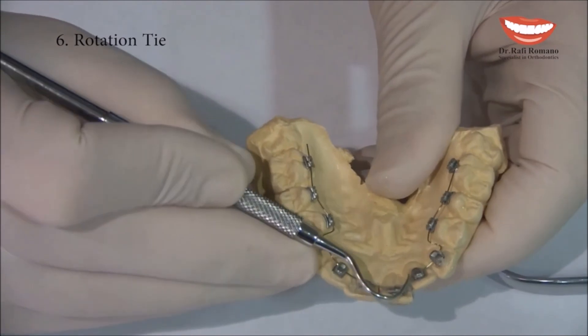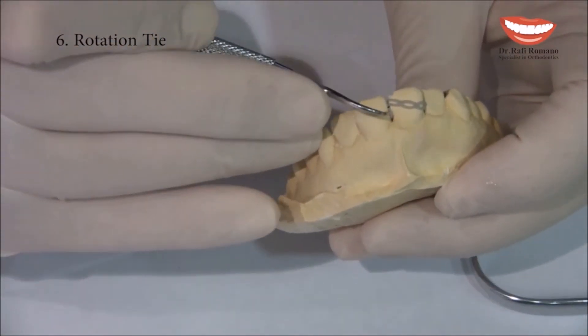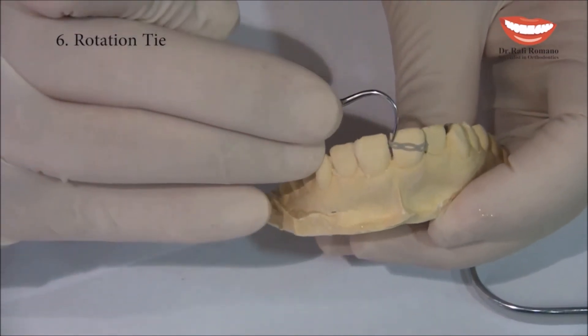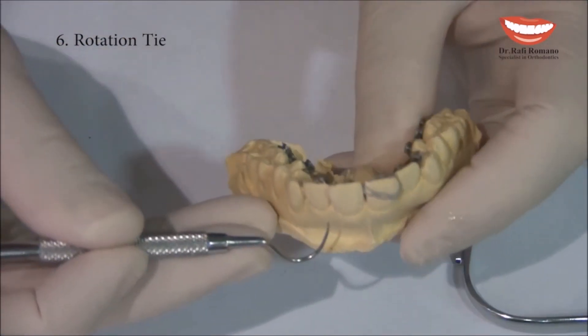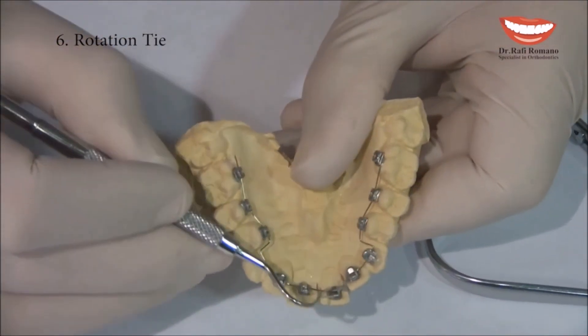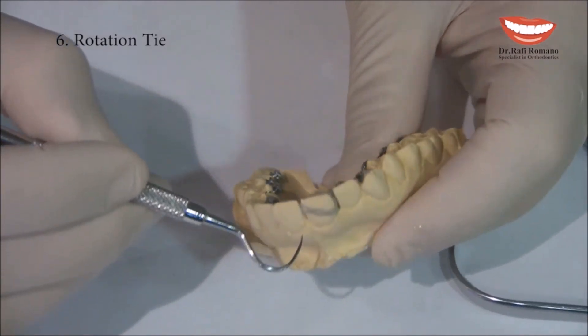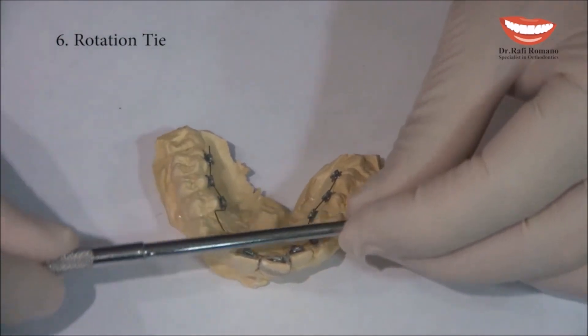You can see how the rotation tie is working: one part is connected to the wire, from the wire it passes around the tooth — in lingual orthodontics we will use transparent power chain — and then from there we go to the bracket. This long chain applies a force to do the rotation.